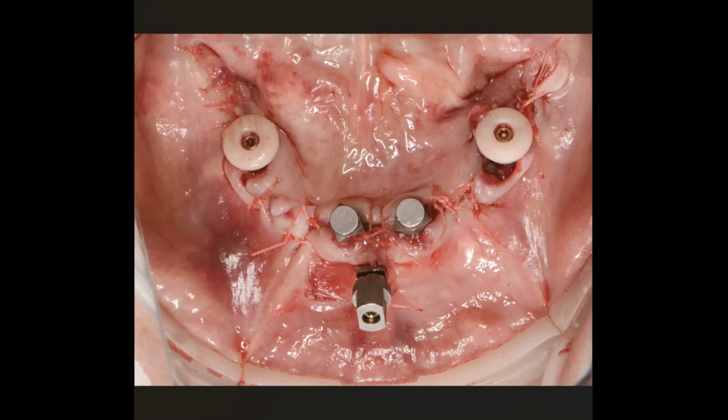I know intraoral scanners have a limitation of their technology, somewhat limited to the size of the field that they can capture. So in a very small area, I can capture the midline fiducial, 23 and 26 in just a few views. I mean, 50 views, 100 views tops, and you don't have to move the camera very far to get all three scan bodies. And that gives us perfect alignment every time.